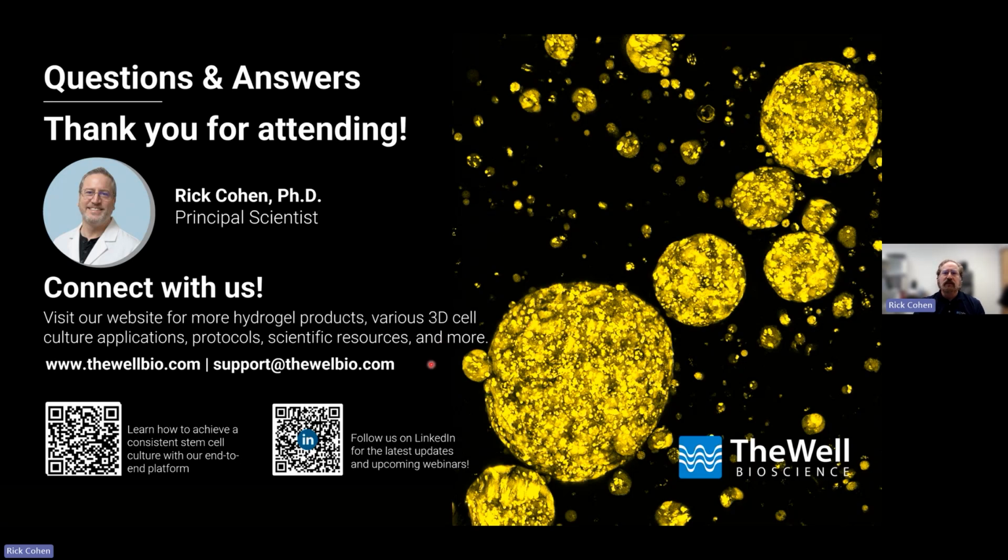So what I would say is take your cell line and try the 100,000 cells. And if you like what you see, continue with that. If not, go lower. And you can even try one cell and see if you're able to clone. We've had some situations where I've input a very small amount in our 2D format and gotten the cells growing. So I know the media is robust enough, but in 3D, I would stick with no less than 50,000 at first.